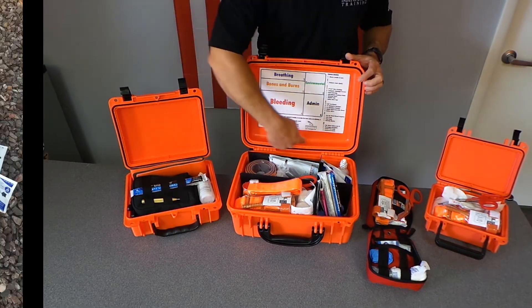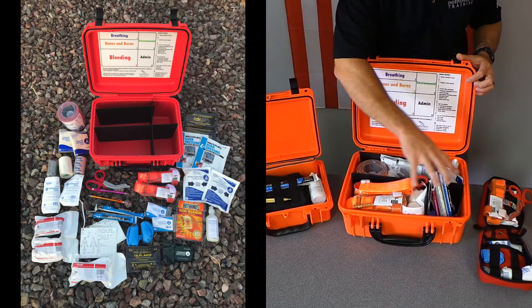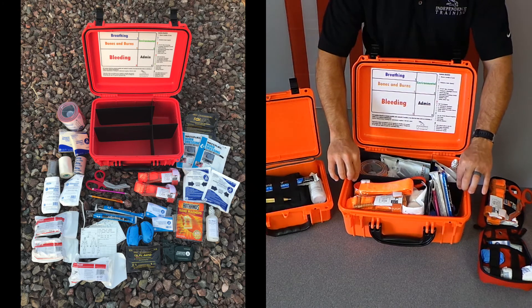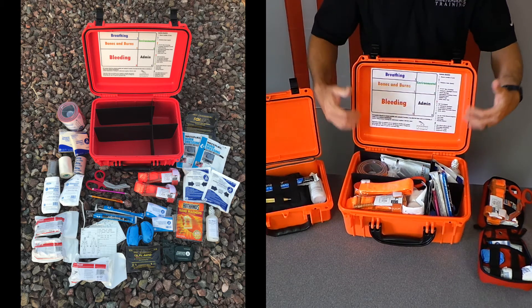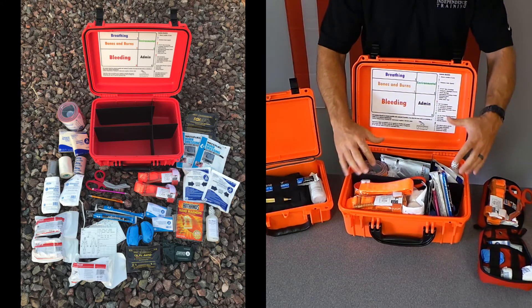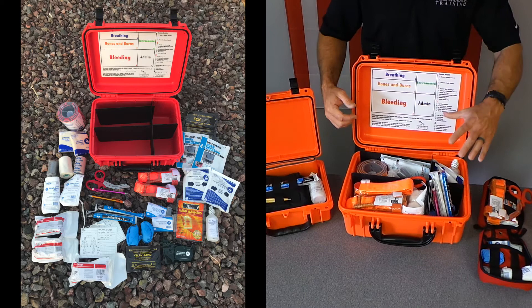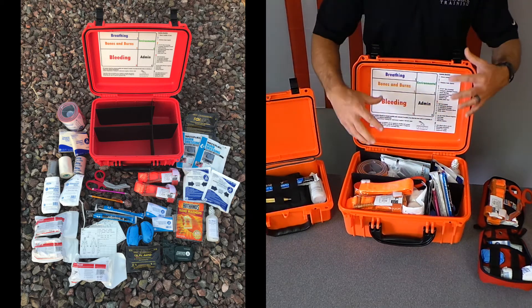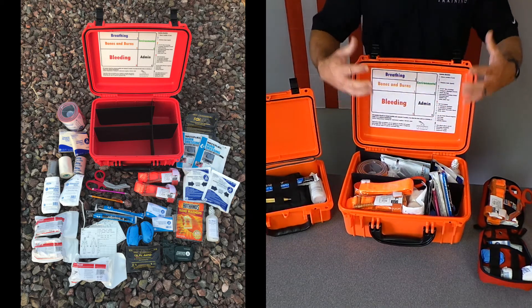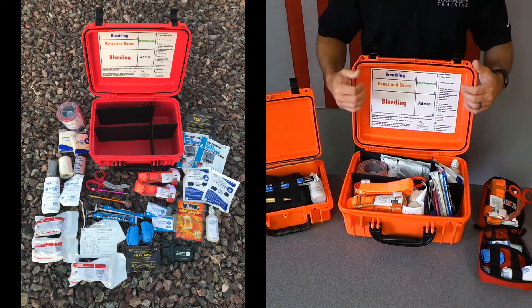So in the MFAC, under the lid, we have a big decal that both shows the areas divided up, which are divided by these very specific ABS dividers so that if I close this kit and shake it up and open it back up, everything's exactly the way that I left it. It also gives you a checklist on the other side that shows you exactly what's going to be in the kit so that you can do inventory, make sure you have what you need, or under stress figure out where everything is.